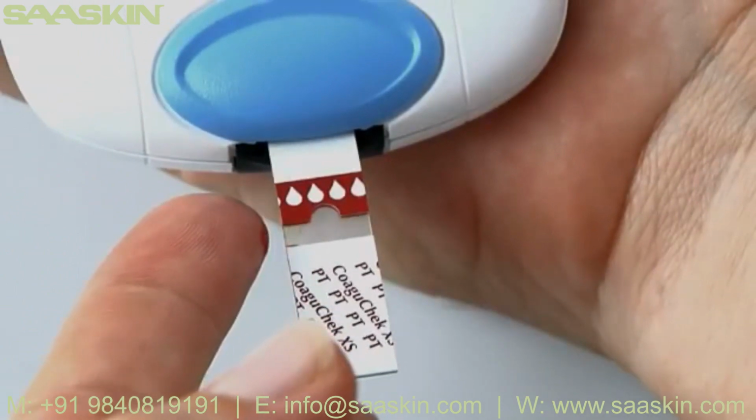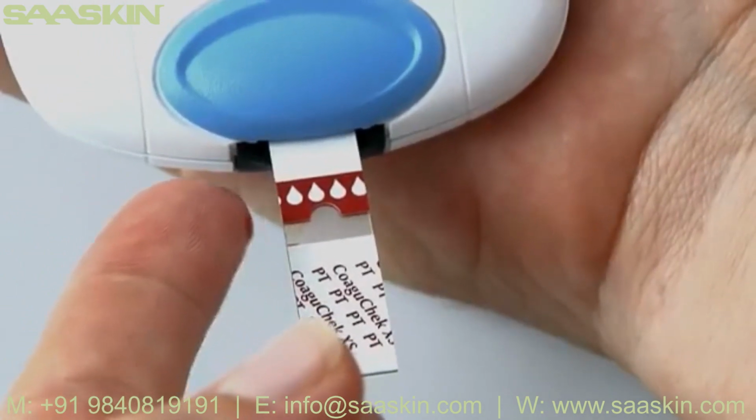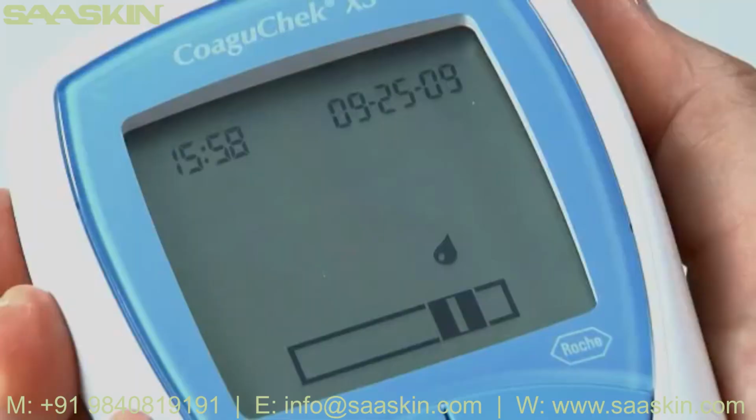The test strip draws up the blood by capillary action. During this process, it is important to hold the blood drop to the test strip until the flashing symbol has disappeared and the meter beeps. At this point, the testing begins.